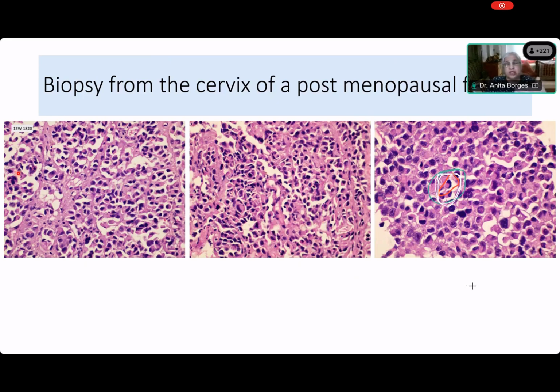Everybody's just allowing anything, calling it a squamous cell. So your differentiation says that it is a squamous cell. Somebody is saying that it is rhabdoid. Somebody is saying that it is signet ring. Somebody said adeno. I don't see any adeno over here. What I see is that there are cells which are in nests, and I can see these nests very clearly. Can I see nests or I don't see nests? Of course I see nests.